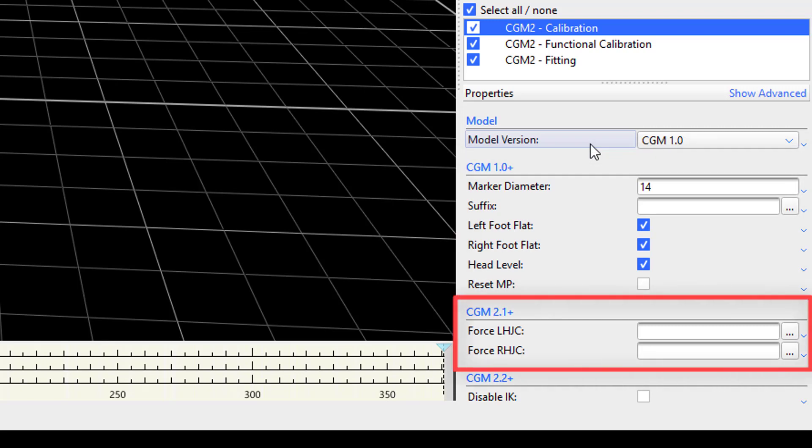The resetmp property allows a user to clear optional parameters such as inter-ASIS distance and recompute. In the next section, for CGM2.1 plus, there are only two properties, whether to force the left hip joint center or the right hip joint center. If you recall, CGM2.1 uses a different hip joint center calculation than CGM1. Thus, these properties allow a user to override the hip joint center calculated by CGM2 and specify their own hip joint center, whether that be the one used within CGM1 or using some other functional method such as SCORE.